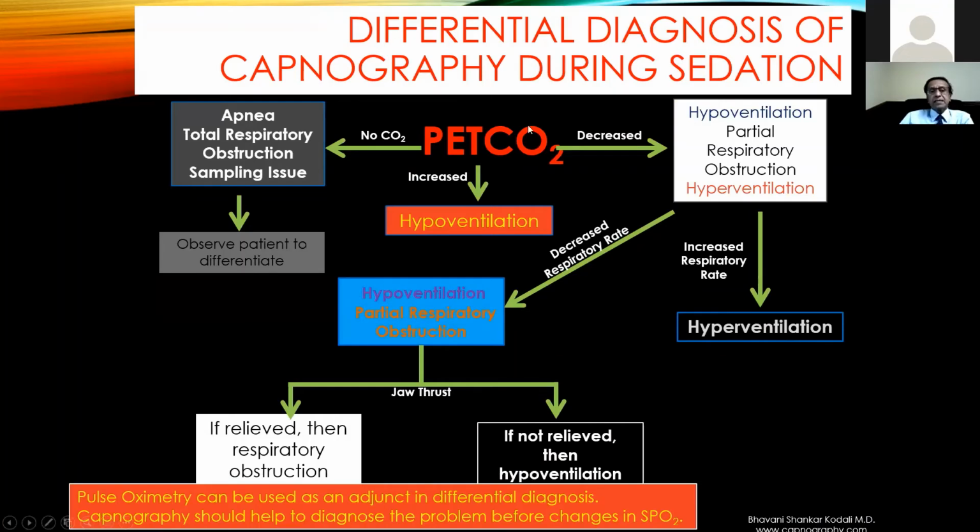This is a differential diagnosis of capnography during sedation. This is an algorithm, and if you go to my website, capnography.com, and go under sedation, you can find this algorithm, and you can study this algorithm and how to use capnography during sedation.